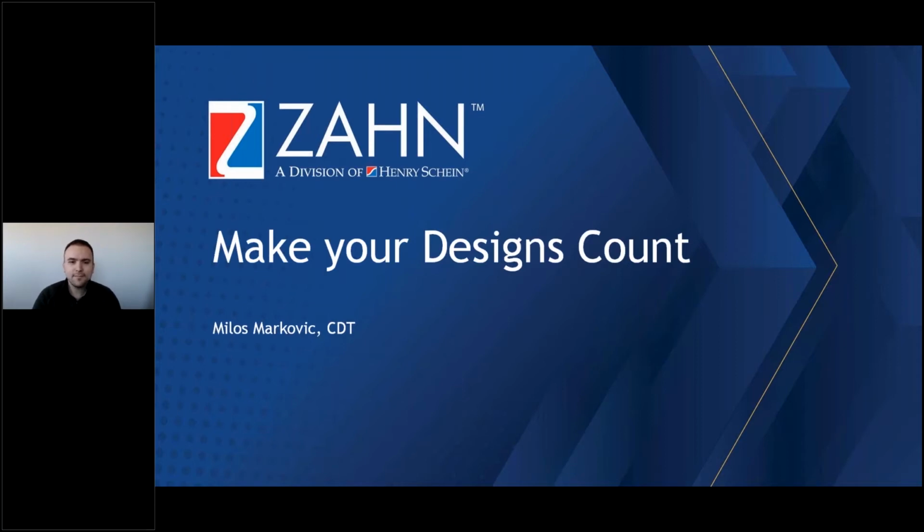Welcome, Milos. Thank you for having me again, and thank you all for joining us today. Today is more of a refresher to go over some of the design preferences and design tricks when you design your bridges. The idea is to save you time, to give you a pointer as to what to focus on when you do your designs, and what to look out for when you deal with digital files. Hopefully today will be a refresher for those of you who are familiar with it, and maybe for those who are not, to learn something new to implement into your workflow.